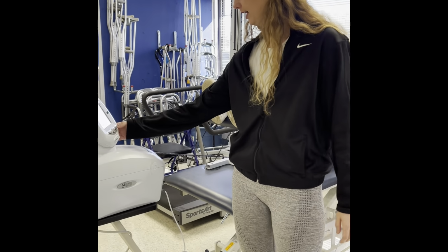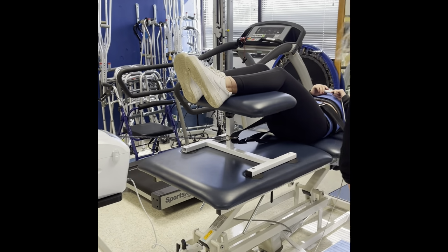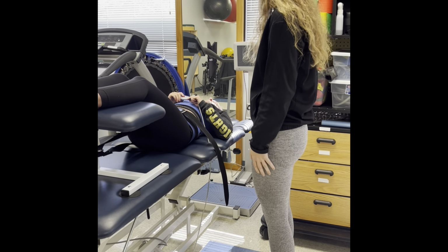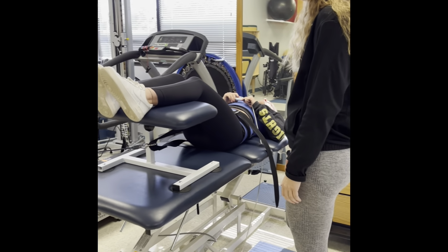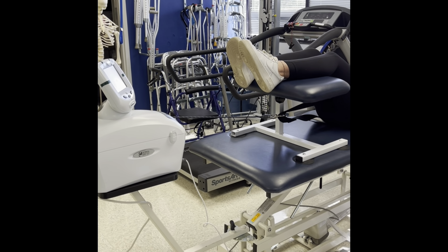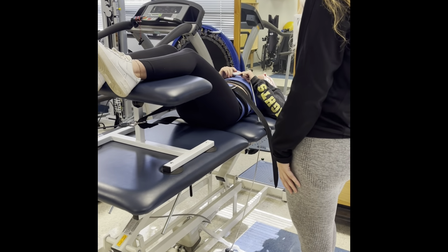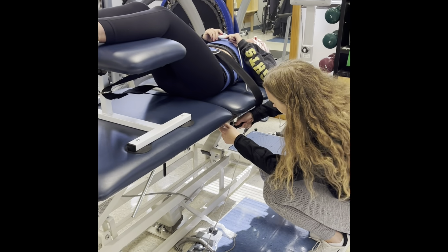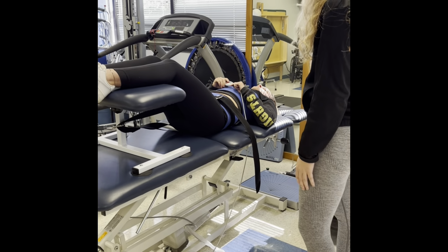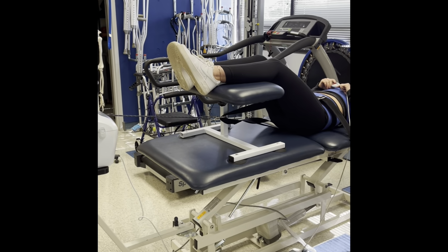I'm going to go ahead and press start. You're going to feel the rope click back there. I'm going to stay with you through this first one. It's going to be pulling for 5 seconds and it's going to relax for 5. Now it's holding: 4, 3, 2, 1. Now it's going back down. Did that feel okay? Now that the first cycle is done, I'm going to unlock the table so that it can shift there. You feel it?